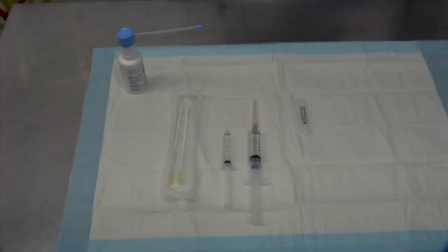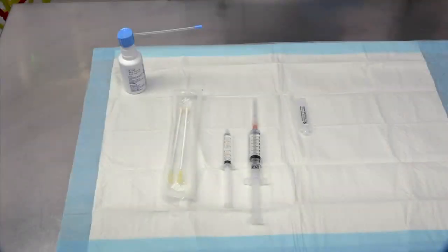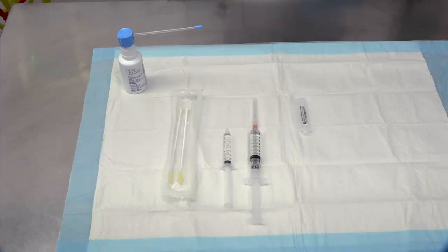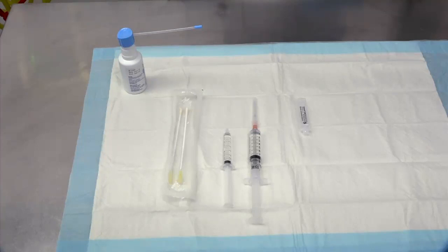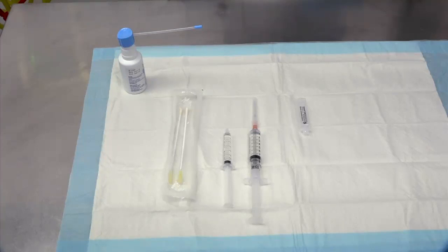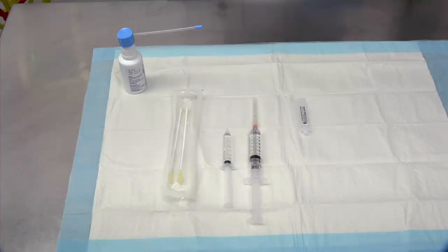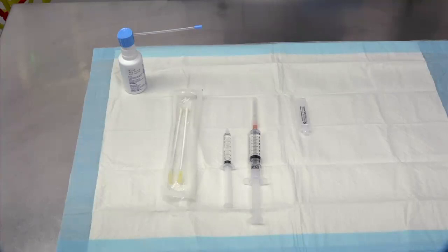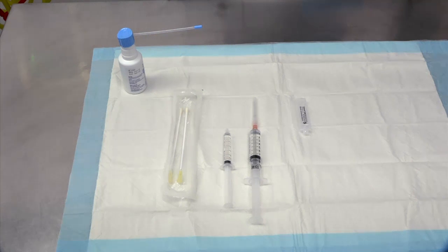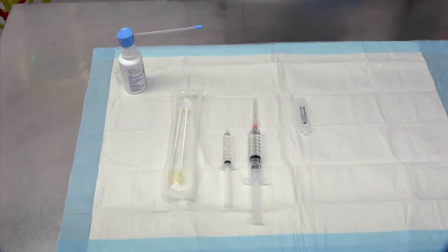In this video I am going to demonstrate how to perform a sphenopalatine ganglion block. Ensure the patient has the appropriate indication for a sphenopalatine block, is consented and does not have any contraindications such as allergies to local anaesthetic or nasal trauma.